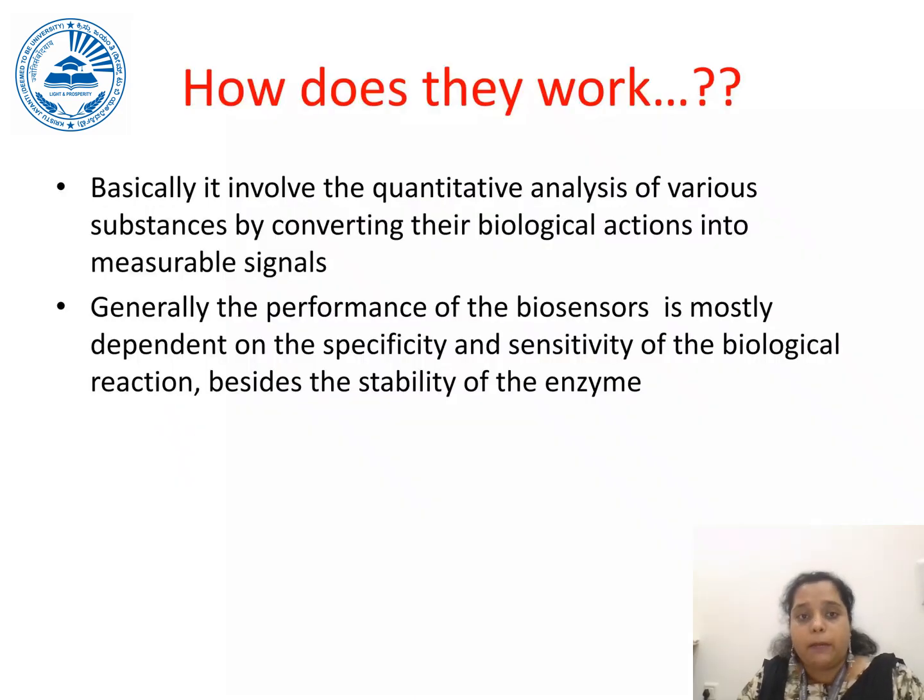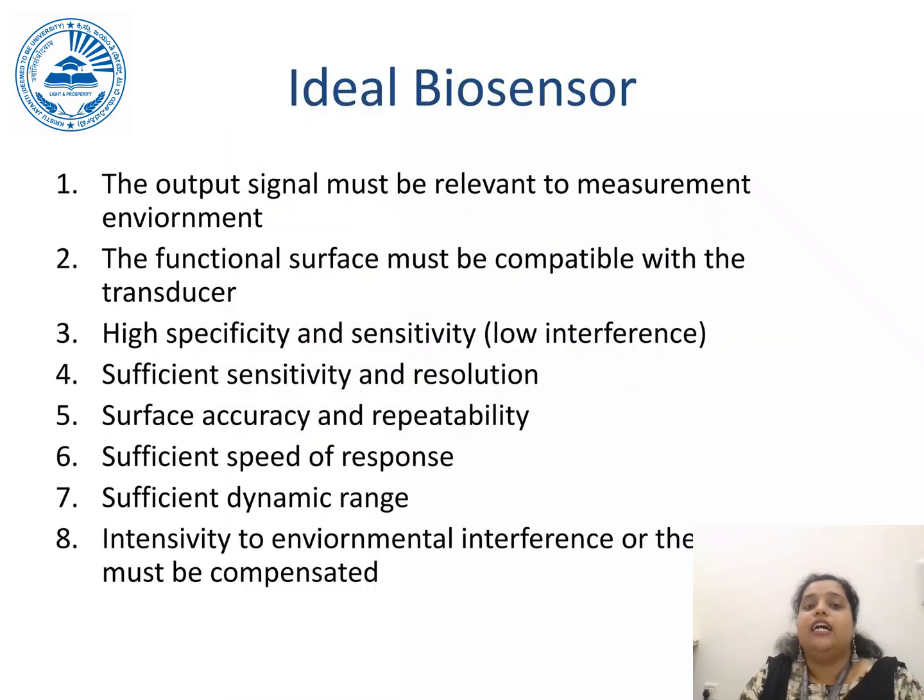Now, how do they work? Basically, it involves a quantitative analysis of various substances by converting their biological actions to measurable signals. Now, generally, the performance of a biosensor is mostly dependent on the specificity and sensitivity of the biological reaction which is occurring, and the stability of that particular enzyme which you are reacting with a particular substrate. So an ideal biosensor is known to have the following properties.